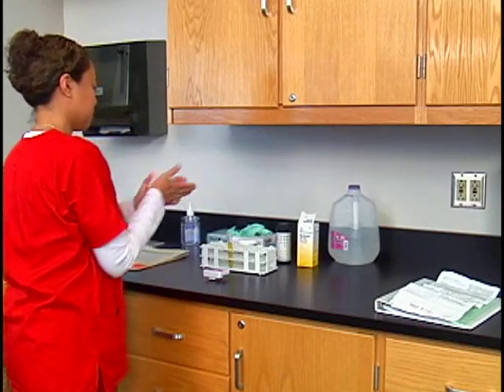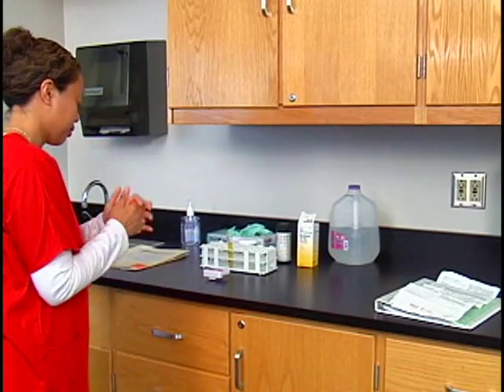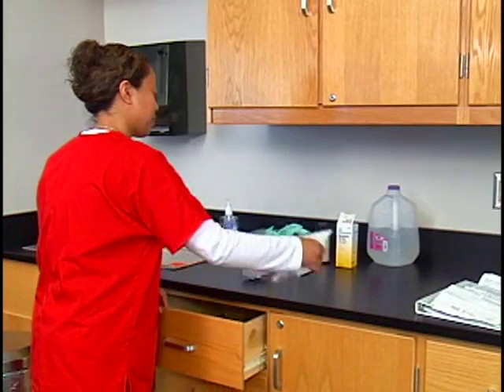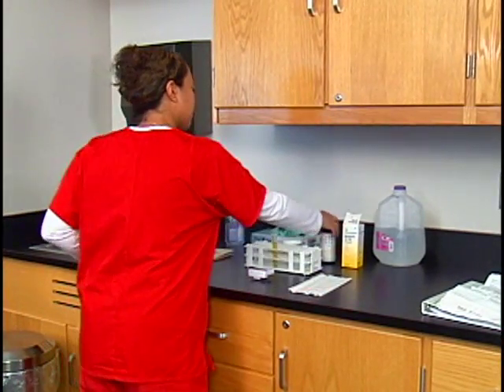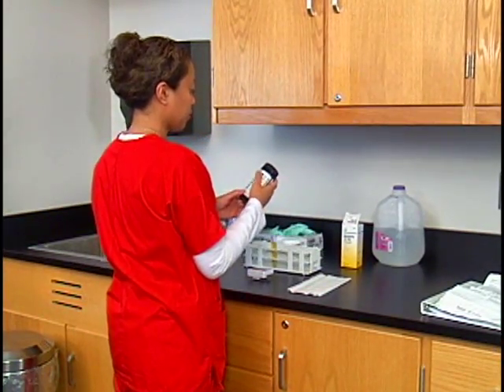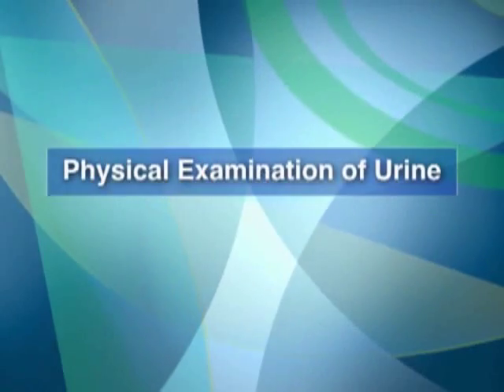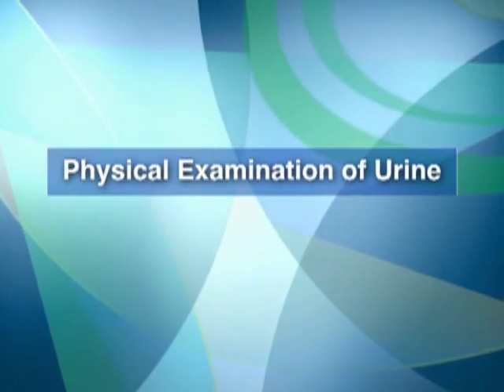Sanitize your hands. Assemble the equipment. You will need the Multistix 10 SG reagent strips, a paper towel, and a timer. Check the expiration date of the reagent strips. Outdated reagent strips may lead to inaccurate test results. The physical examination of the urine is performed first.